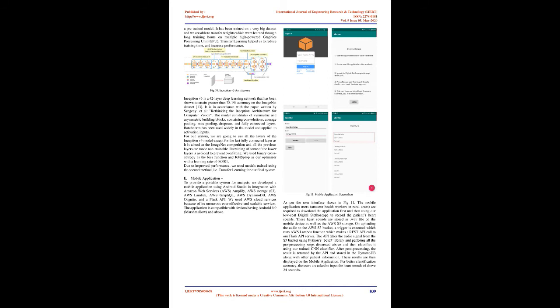Method 1, using our CNN architecture. We built a CNN model comprising 3 pairs of convolution and max pooling layers followed by a flattening layer, a fully connected layer, and the output layer. Input image spectrograms transformed into 64x64x3 input shape. Convolution layer 1: kernel size equals 3x3, number of kernels equals 32, stride equals 1, activation equals ReLU, padding equals same. The purpose of the convolution layer is to perform the convolution operation so as to extract high-level features such as edges from the input image.